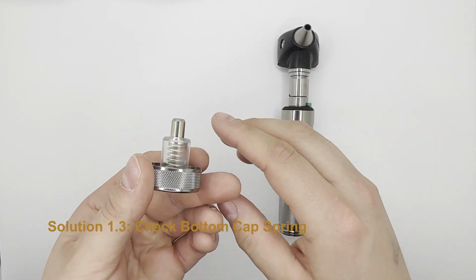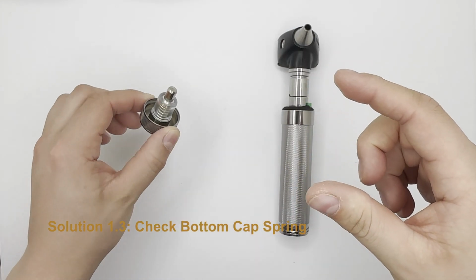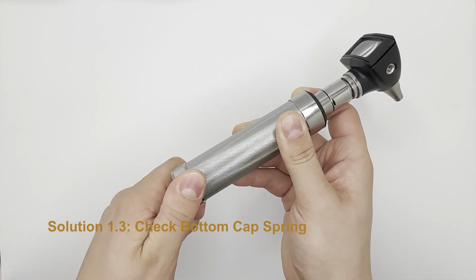This spring holds the battery in place to enable electrical connections, so it's essential that it's present and interfacing with the battery. If it's not, a new bottom cap spring may need to be purchased. Screw the bottom cap spring back onto the bottom of the handle.